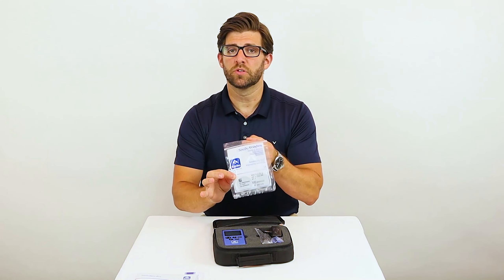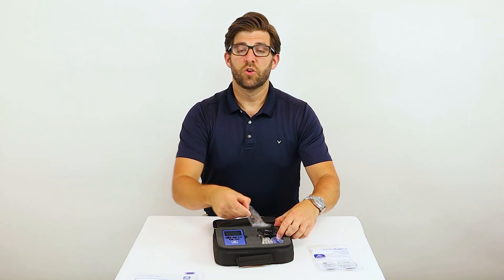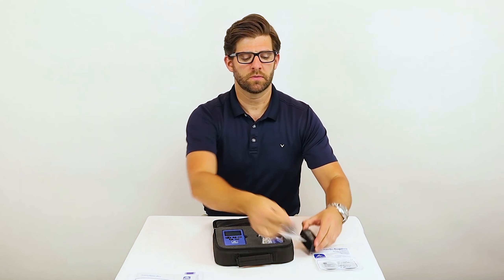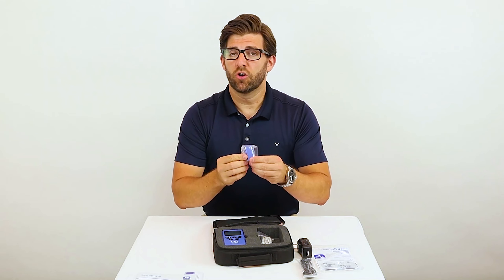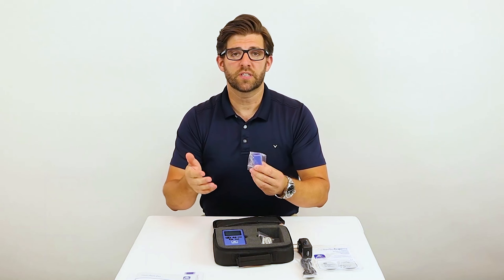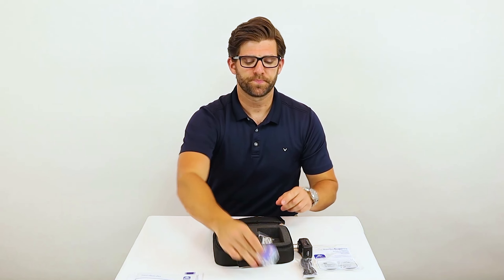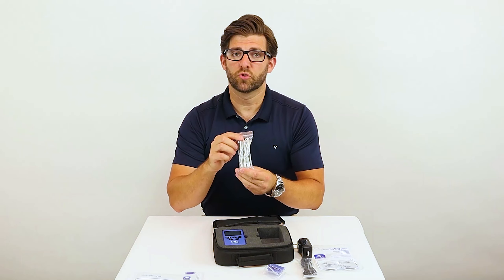Next, you'll find Sabotrodes. Hold on to these. You have a power cord and in the US only a power adapter. You have a waist clip in case you are wearing yoga pants or gym shorts or another type of clothing that you don't have a pocket to put the Sable Stim Pro into. You have your lead wires that go with your Sabotrodes.